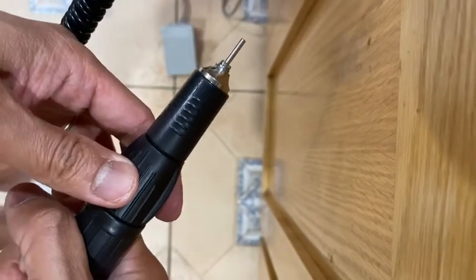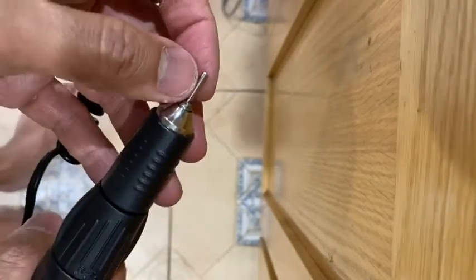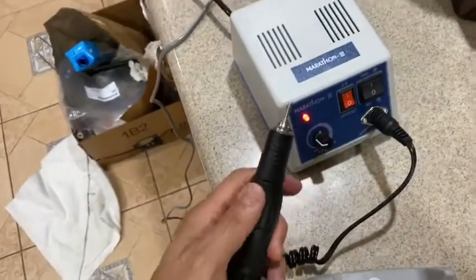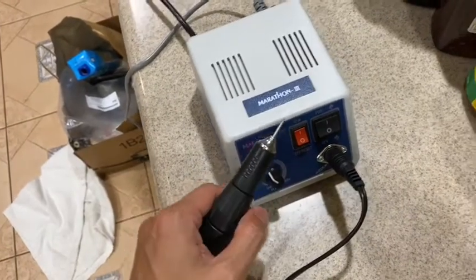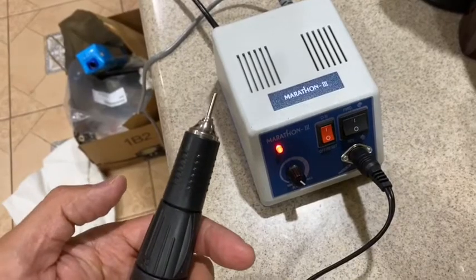I really like this tool. Let me show you the sound of this motor instrument. It's really nice — not loud at all. I'm going to turn it on at maximum power — see, very nice sound. I love it.